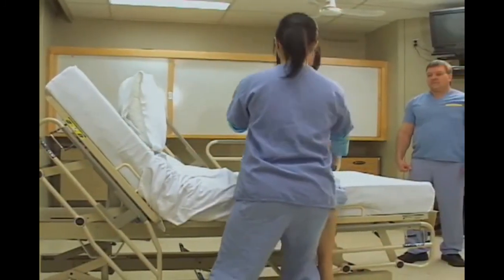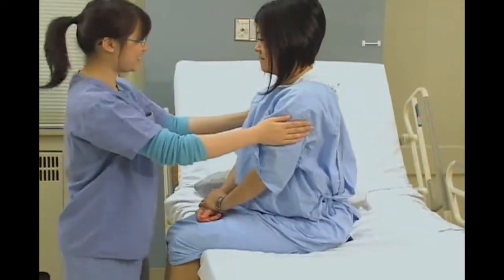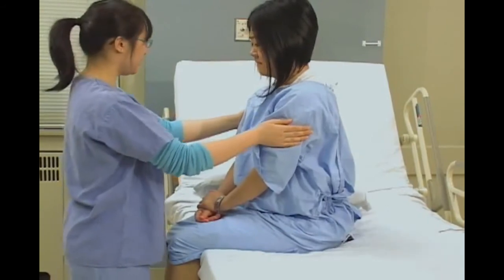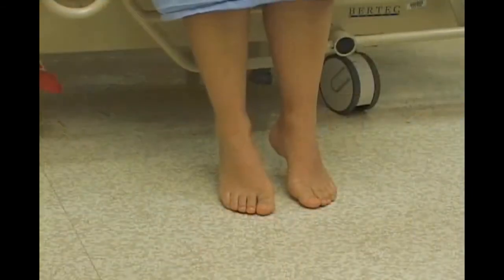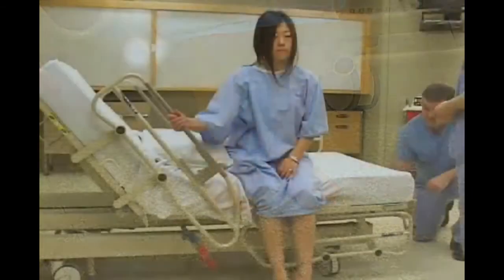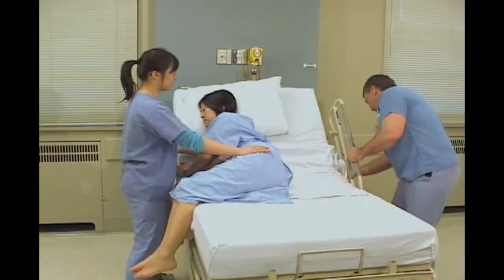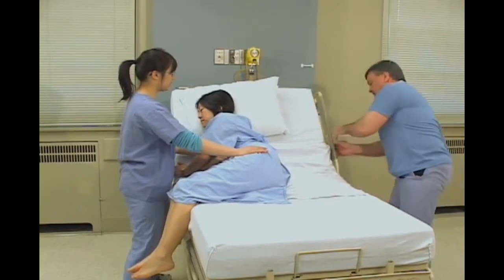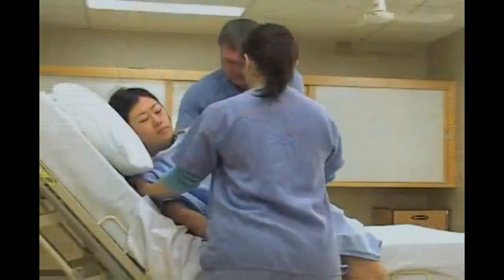On the designated count, perform a side-to-side weight shift while pressing down on the patient's upper hip with one hand and guiding the patient up with the other hand placed behind the patient's shoulder. Once the patient is in an upright seated position, ensure she can sit independently or stabilize her. If the bed has split side rails, raise the rail at the head of the bed so the patient can hold onto it. Lower the bed height to allow the patient's feet to rest flat on the floor, with hips slightly higher than knees to make it easier for her to stand. If the patient has limited trunk strength, a second caregiver may be required to kneel on the bed directly behind the patient, placing both hands on the patient's shoulders to assist.